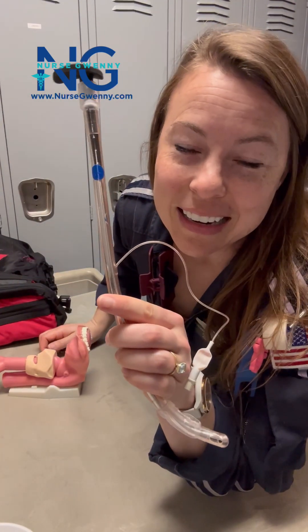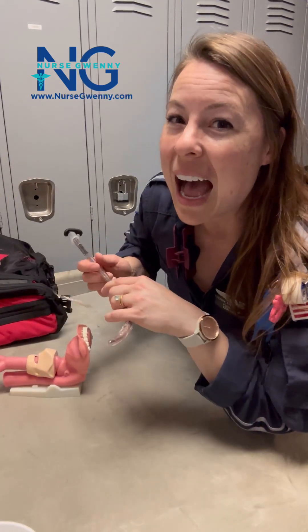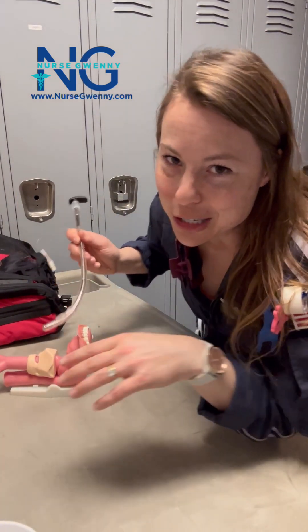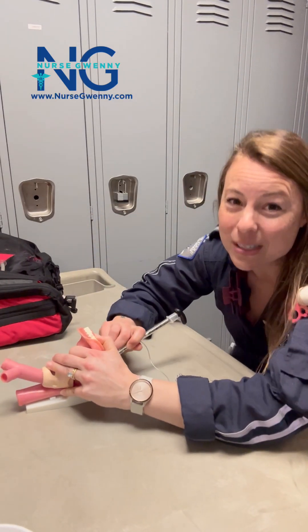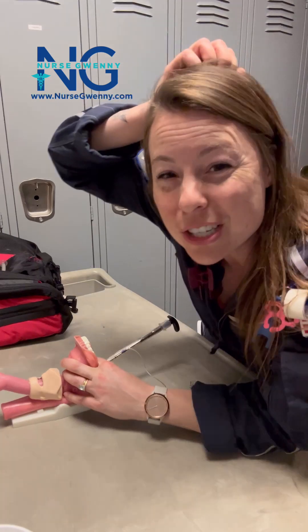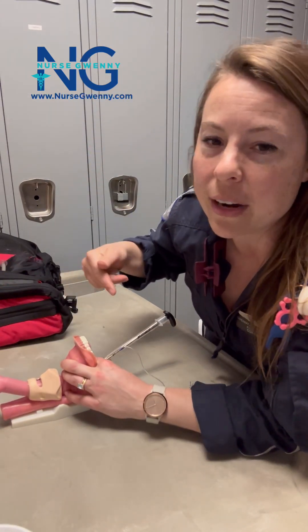A rigid stylet is a great tool to use when intubating your patient, especially if you're using a hyperangulated blade on your laryngoscope. I am much preferential to using a bougie, but if you're using the hyperangulated blade on your video laryngoscope, your bougie can't make the turn that you need with that hyperangulated blade.